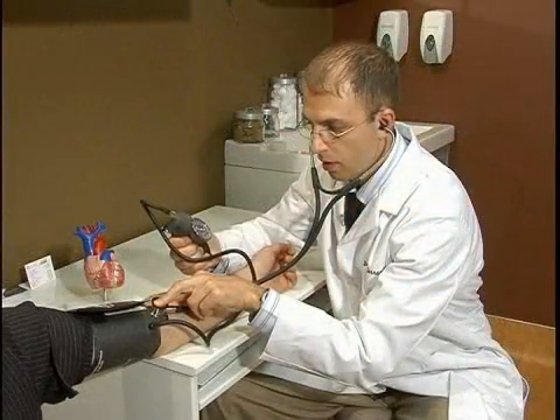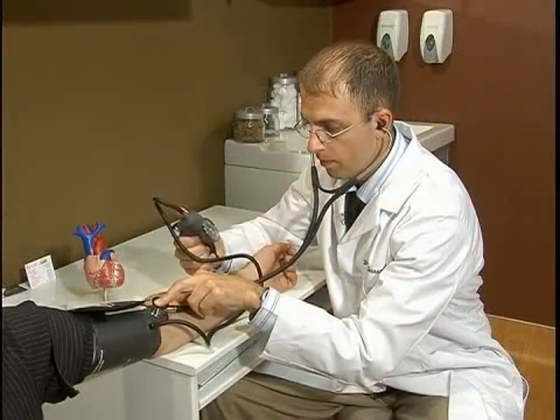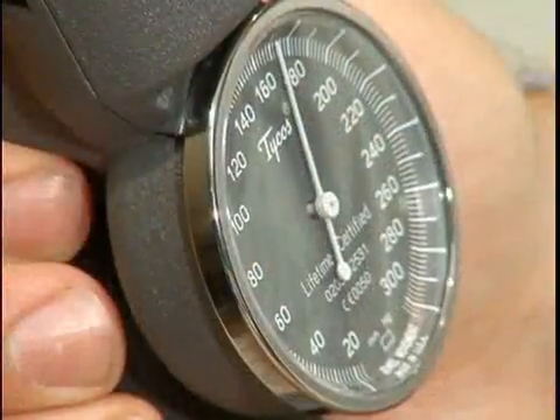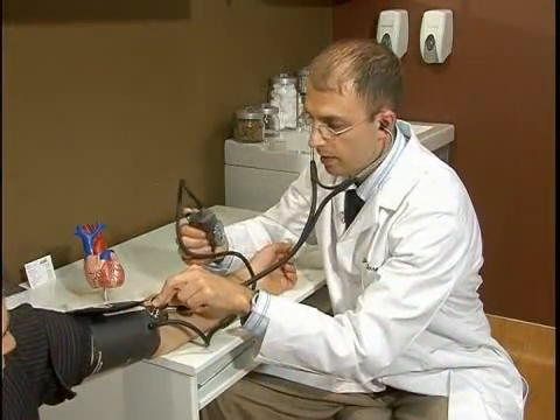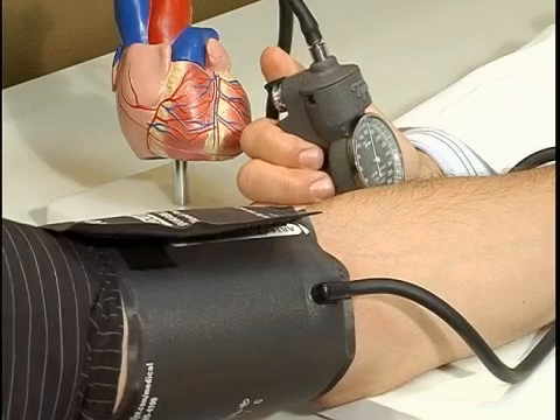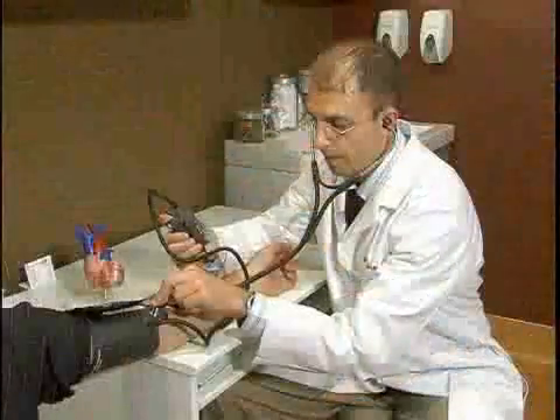And then we're going to go 30 millimeters of mercury above that, and that's where we're going to stop — and that's how you inflate the cuff.